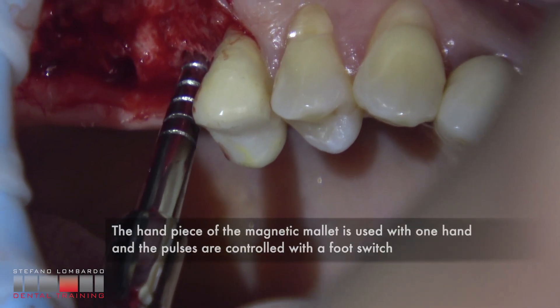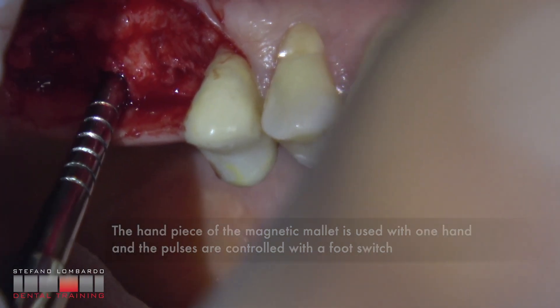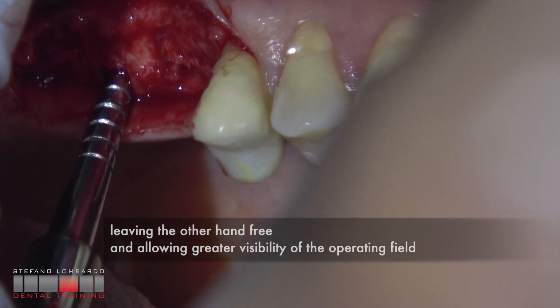The handpiece of the magnetic mallet is used with one hand and the pulses are controlled with a foot switch, leaving the other hand free and allowing greater visibility of the operating field.